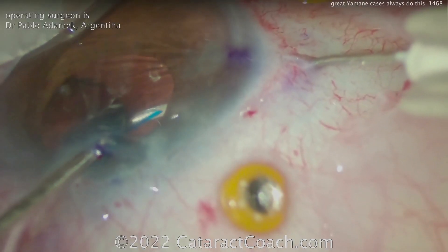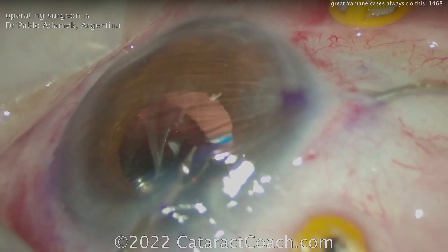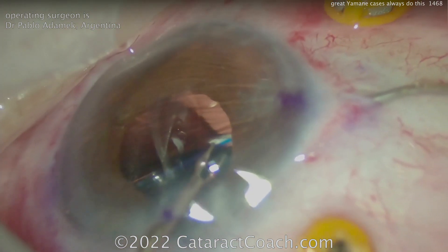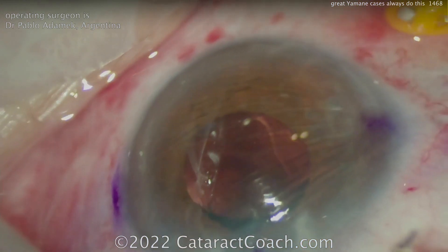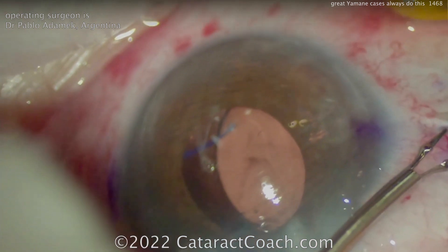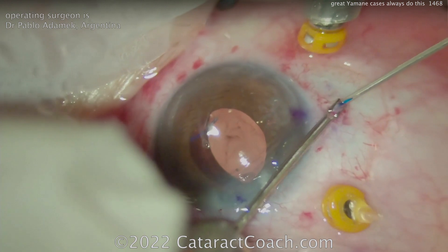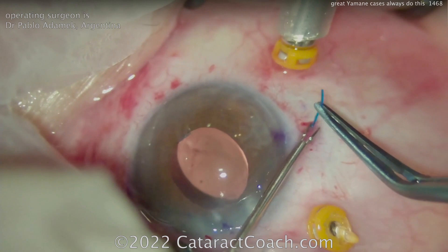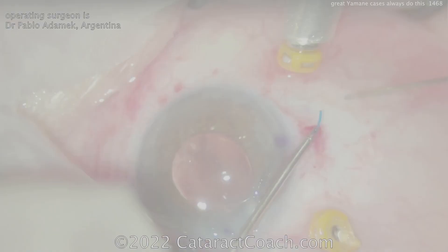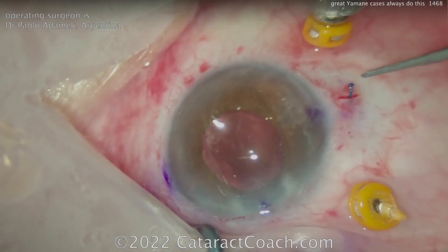The IOL calculations in Yamane procedures are a little less accurate because you can't always predict exactly the effect of lens position. Look — getting that second haptic in, where's the optic? Deep in the mid-vitreous. You really have to admit to yourself that these patients are better served with a complete, full pars plana vitrectomy. That's what's happening here. Plus, the other advantage is that the pars plana infusion line is so helpful to keep the eye inflated during all these procedures. If you don't have that pars plana infusion line, it's much more difficult.